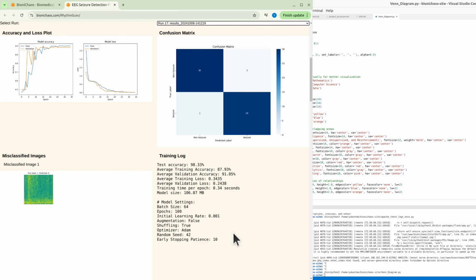Then we added early stopping patience, but that is not actually taking effect during this run. Getting 98%, everything else is the same. 98, 96. Yeah, so it's hard to tell the variability of the noise for the test accuracy when you do multiple runs with the same settings.